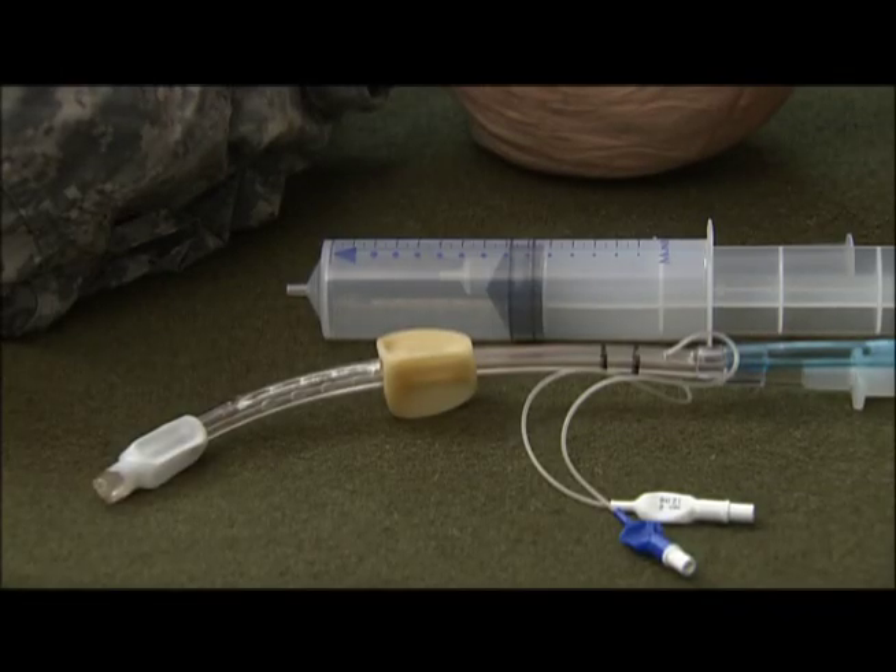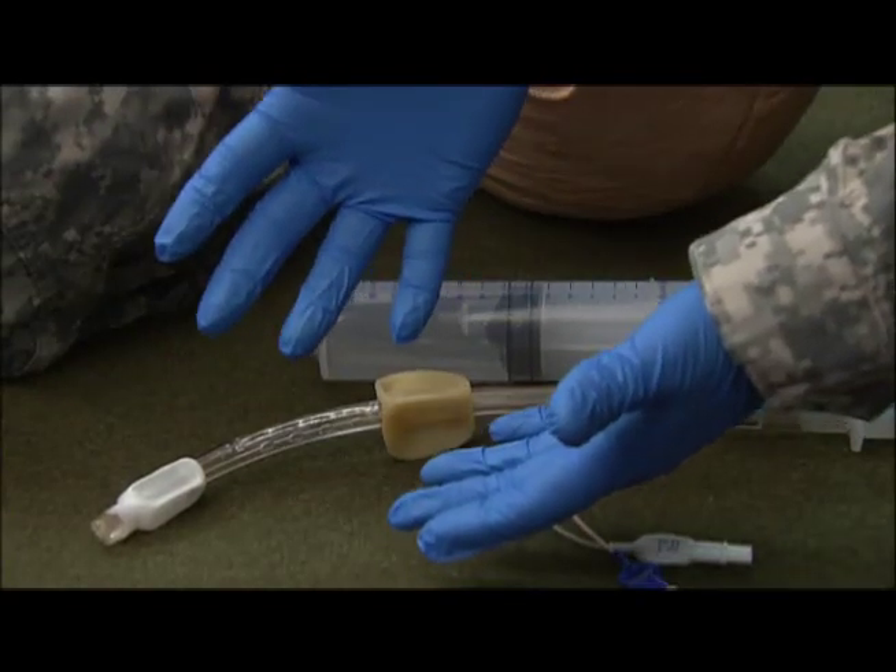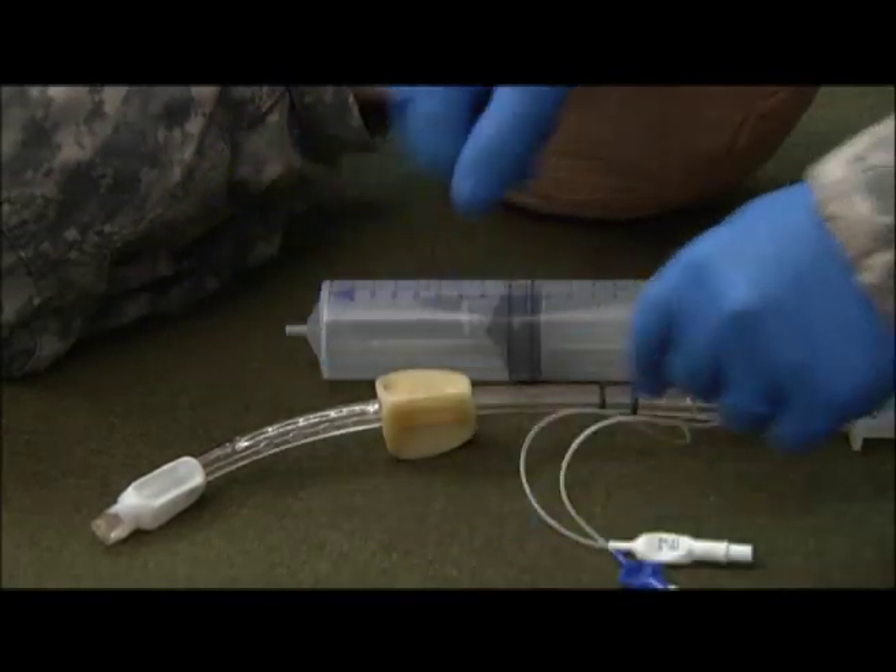This demonstration will be the proper insertion of a combi tube. The first step you want to take in any medical procedure is make sure you have proper BSI.